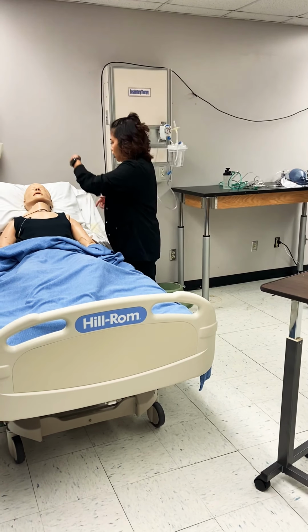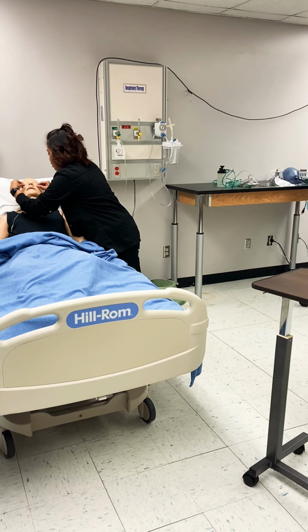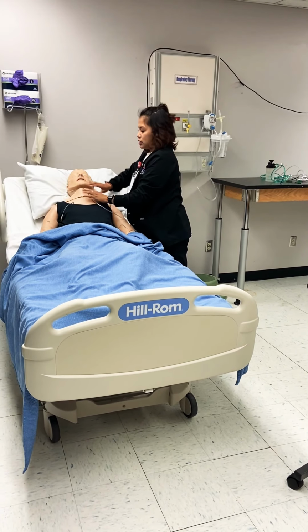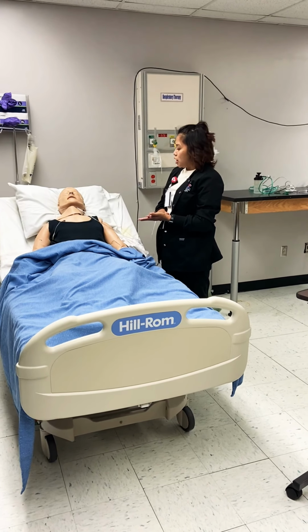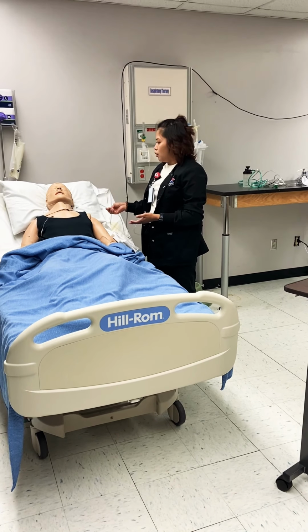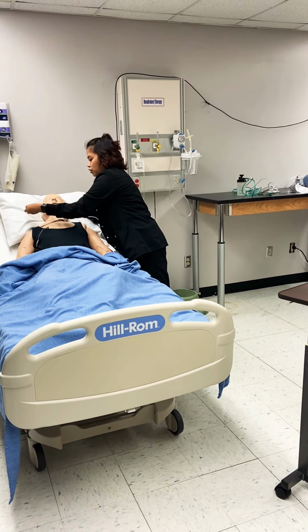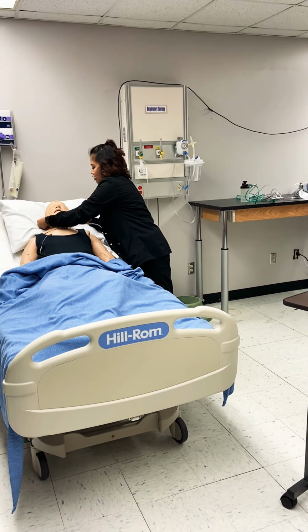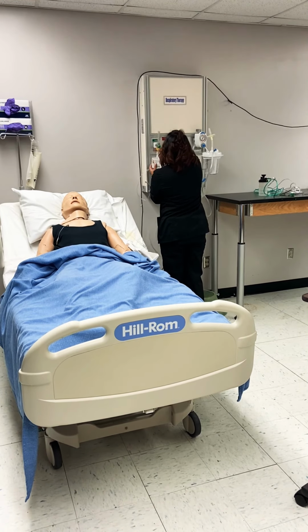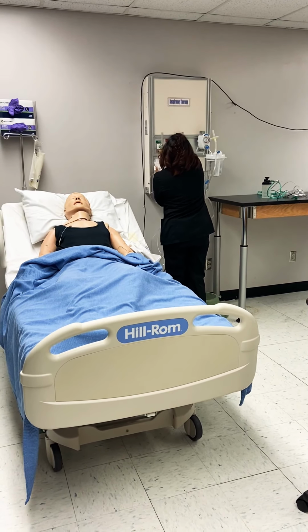Then you come over here and put it on the patient. So you want the prongs down, and you go around the ear, and you make sure that's about comfortable. An advantage is it's easy to use, and it's a low-cost device. A disadvantage is patients can remove it and dislodge it, and it can cause dryness. The FiO2 is 22 to 40%.